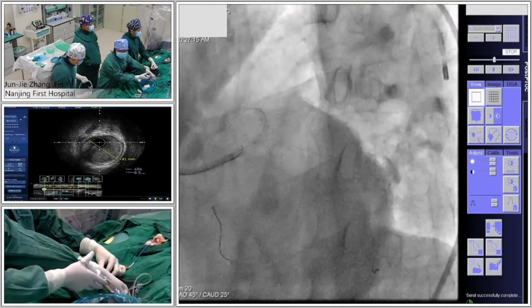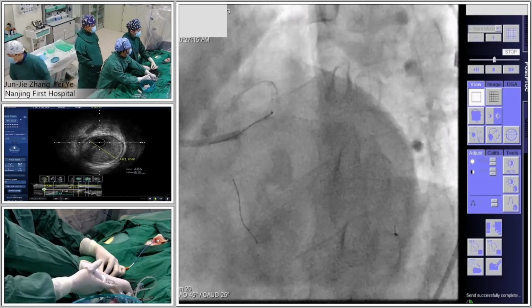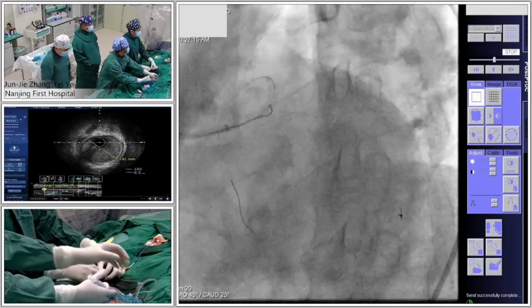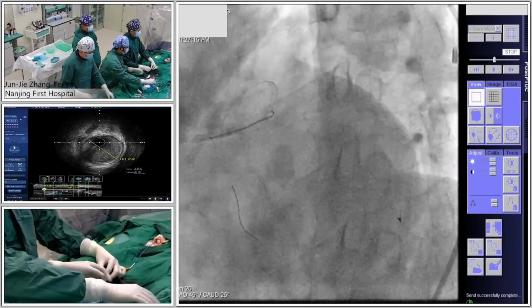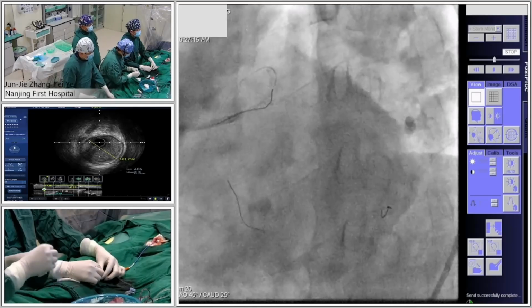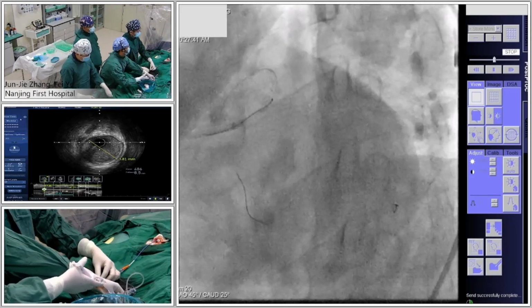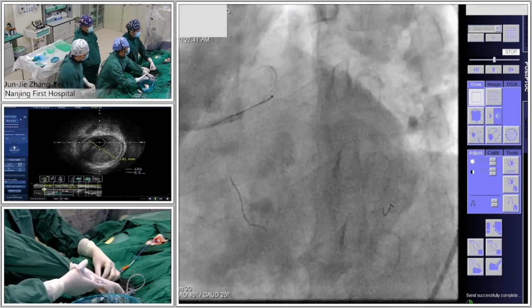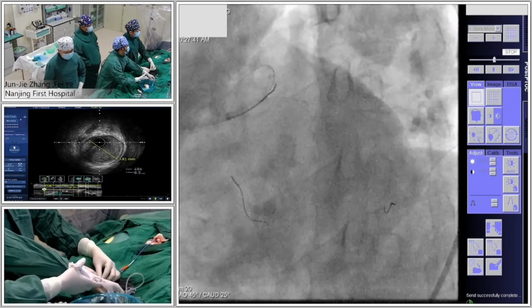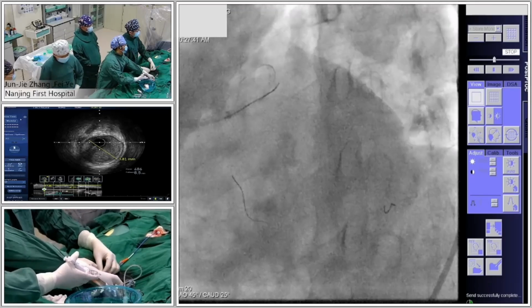Prepare the dual lumen catheter. So protecting the big side branch is very important, because there is this severe stenosis at the main vessel. After 3.0 balloon predilation, there will be plaque shift and increased difficulty for rewiring the side branch. So in this scenario, I think the dual lumen catheter will facilitate wiring the side branch.